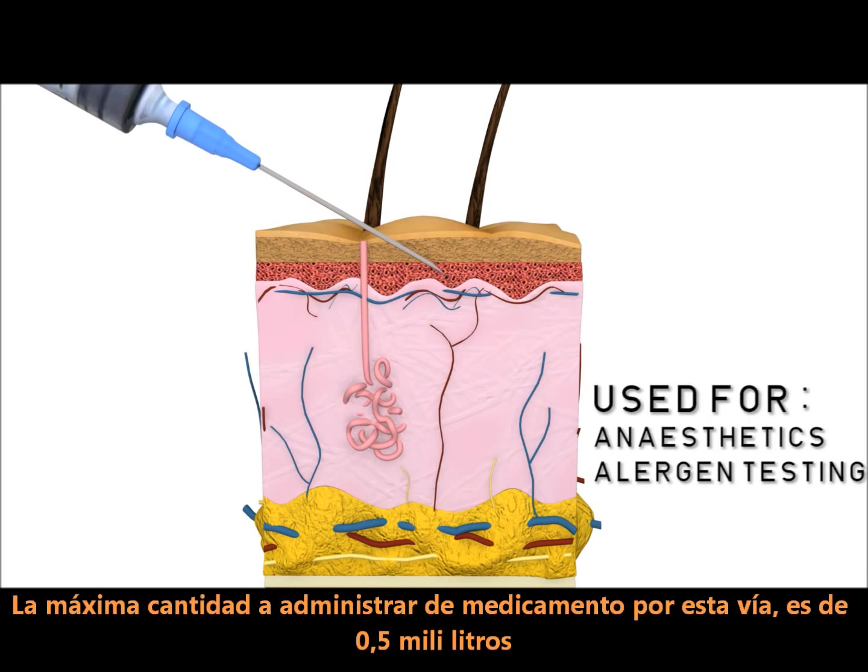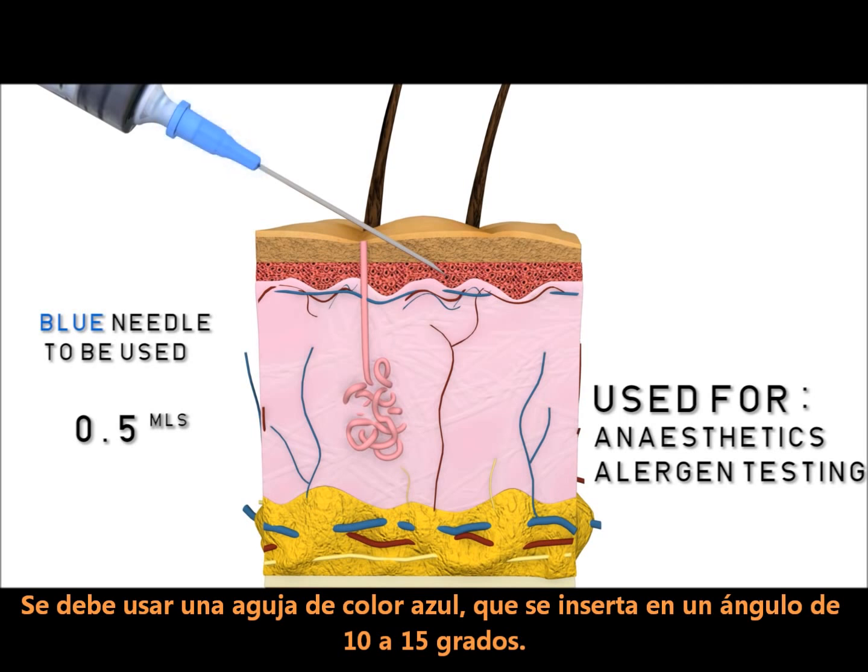A maximum amount of 0.5 mL of medication can be given. A blue needle should be used and inserted at a 10 to 15 degree angle.